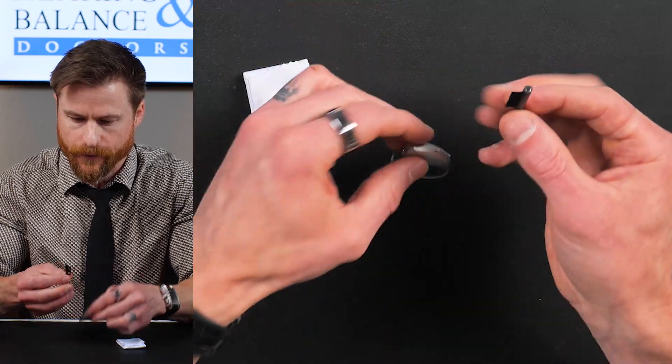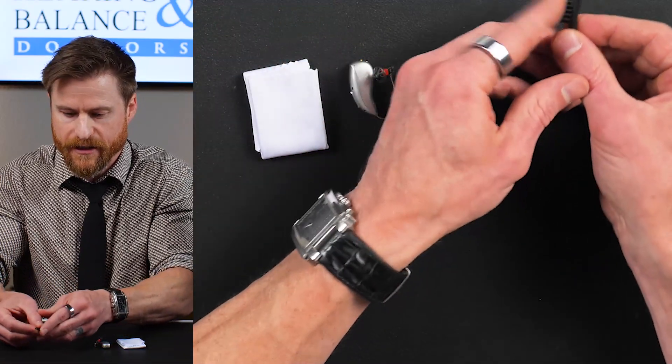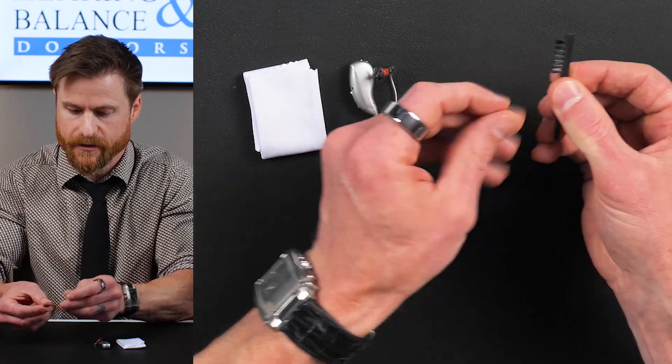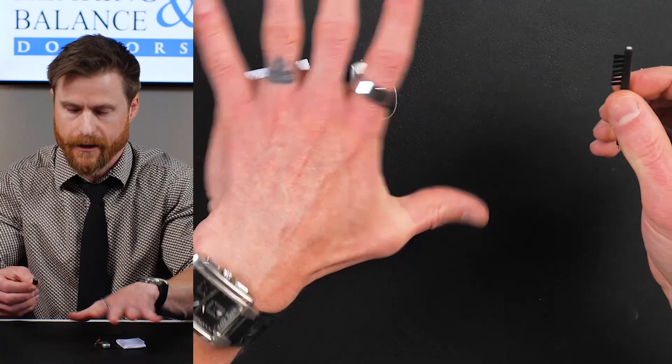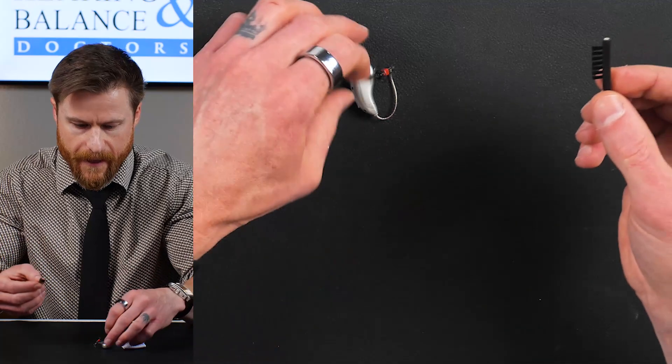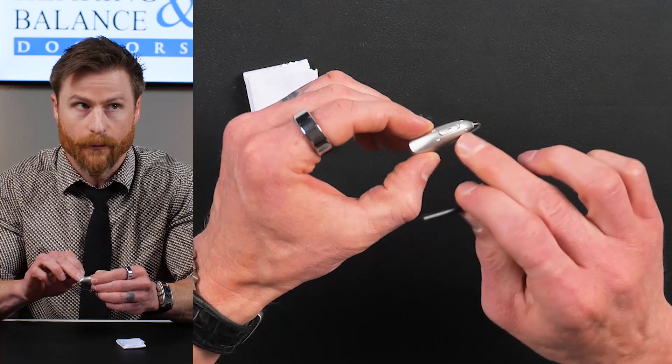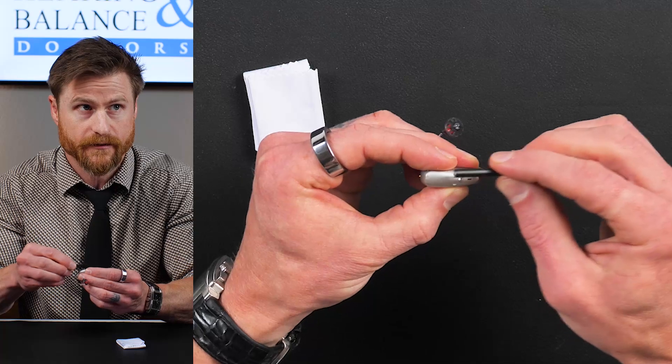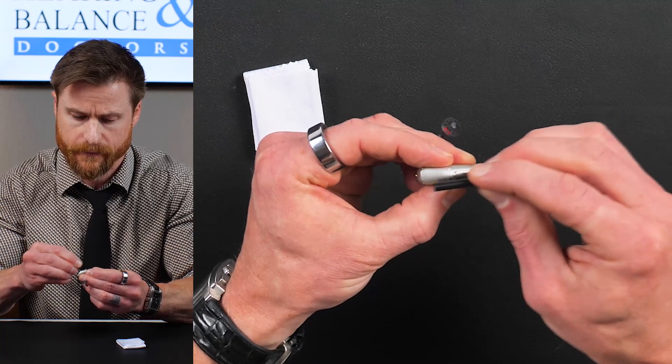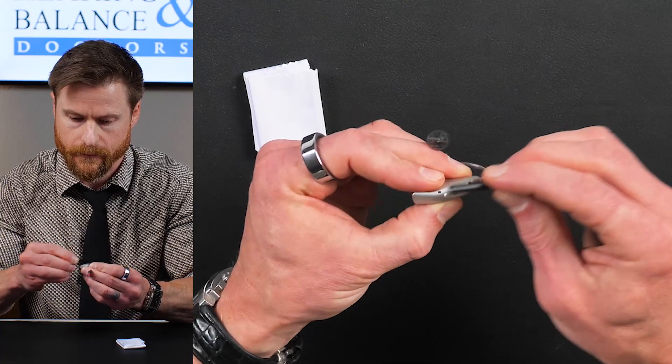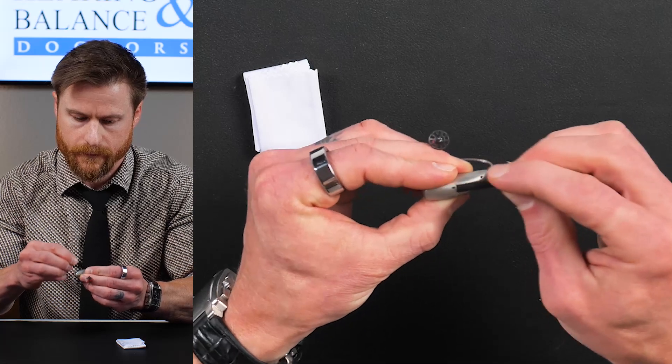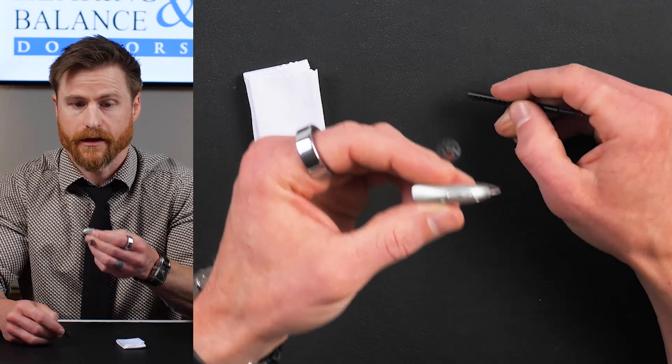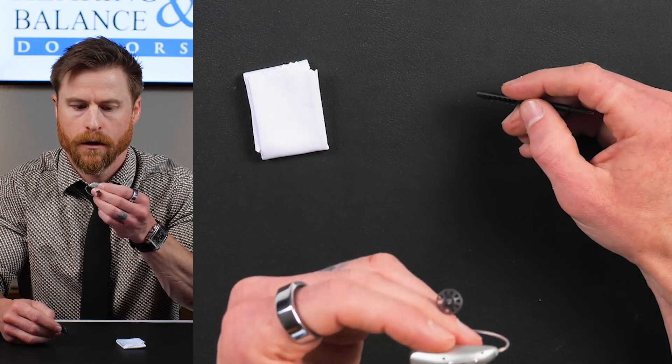So the first thing you should do is, this is what I do. I kind of just brush these bristles in the morning before I even touch the hearing aid to get off any other stuff that was left on. And then I get the microphone ports first. So you can just go across, just like this. Just across. And then I just go like this at the end, really quick.